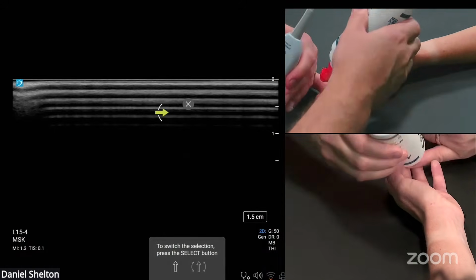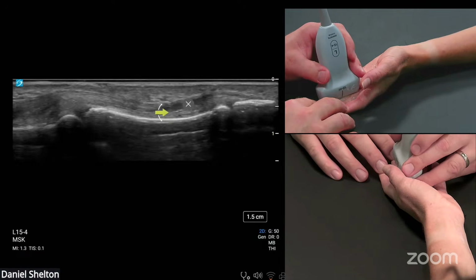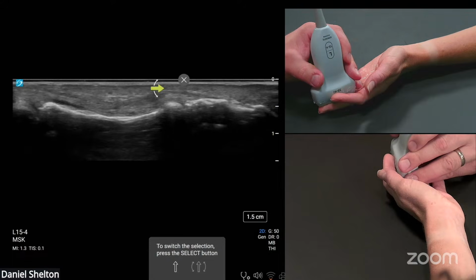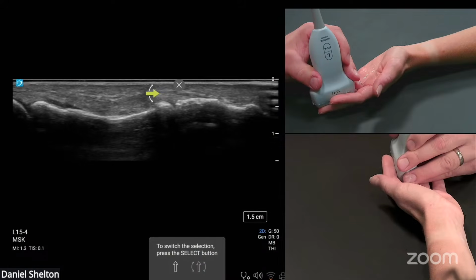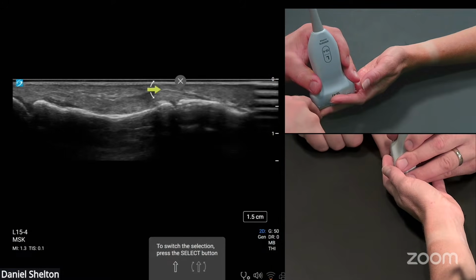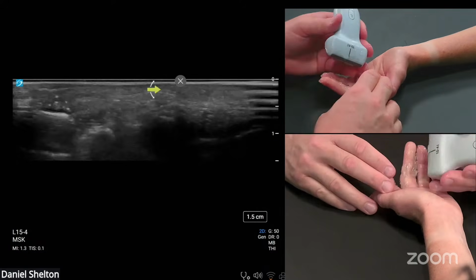And over the shaft of the middle phalanx, we get A4. So here we are over the shaft of the middle phalanx. We should get a bright white hyperechoic thin band right on over the shaft. That's your A4. And then up here we have A5, another bright white connective tissue layer right there between the arrow and the X. And again, if you're confused as to what tissue is what, move the phalanx, rock the fat under the skin, and make it move. Also easier to see in transverse.